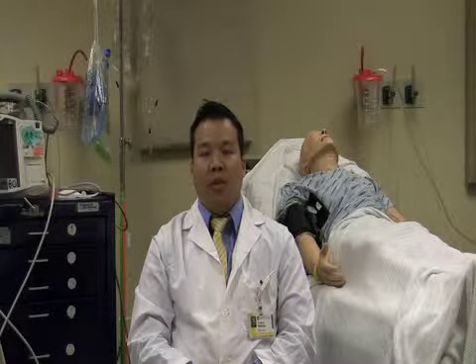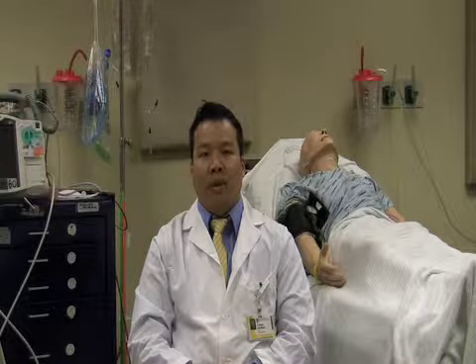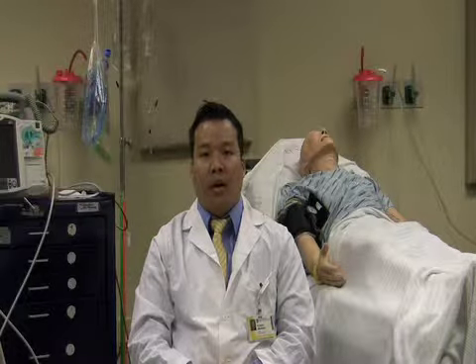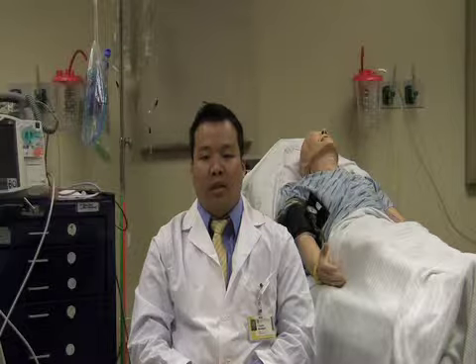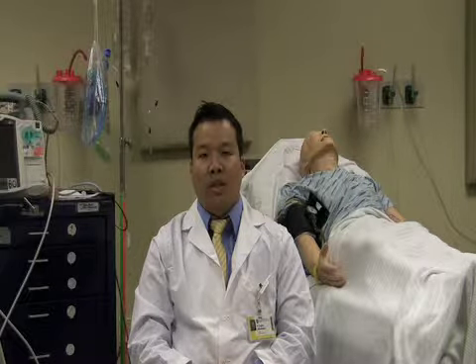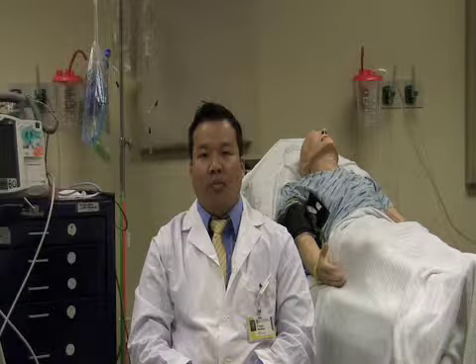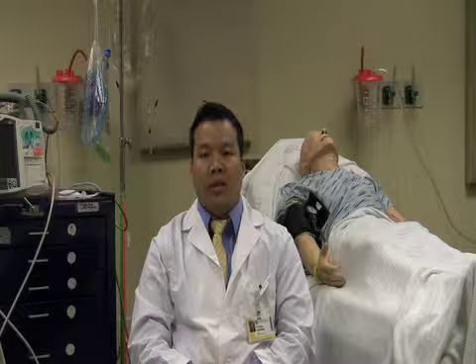Patients with complaints of pacemaker malfunctions typically will have their pacemaker interrogated in the emergency department or in the hospital once they are admitted. For this reason, it is important to know the particular brand of the pacemaker, as it will allow us to contact the proper technologist to actually analyze these pacemakers.